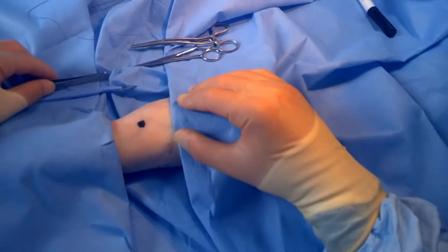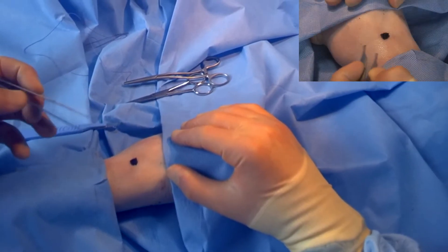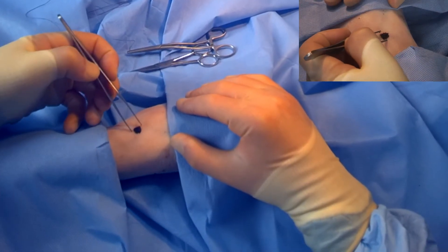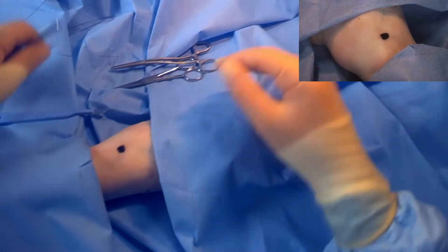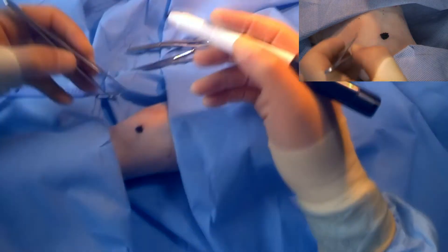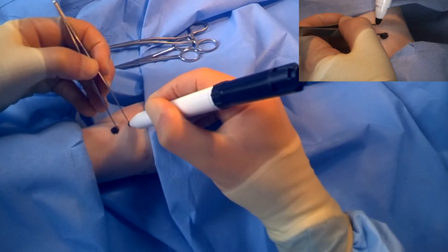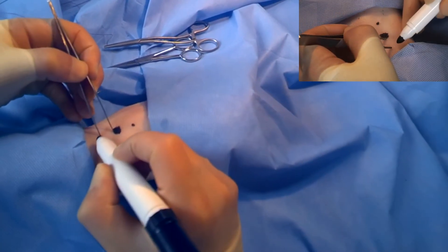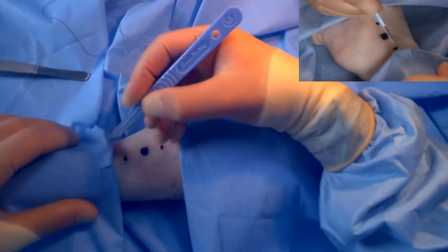It's important initially to make sure that your wound is three times the length of the lesion. This can be measured out with forceps or with a tape. Now to make the incision.